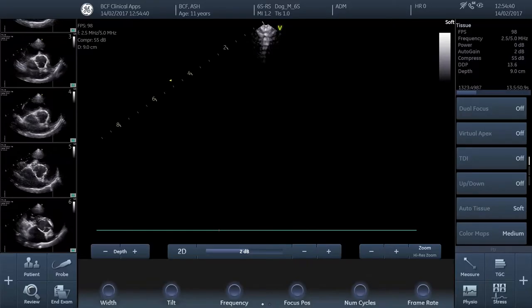Mode scan in the right parasternal short axis view at the level of the mitral valve. If you're already happy and confident acquiring that view, then please carry on. But if you'd like details about how to acquire it, then please click on the link at the end of this video — that'll take you to our basic echocardiography video series. It's worth spending some time practicing to make sure you can acquire it accurately and reliably.